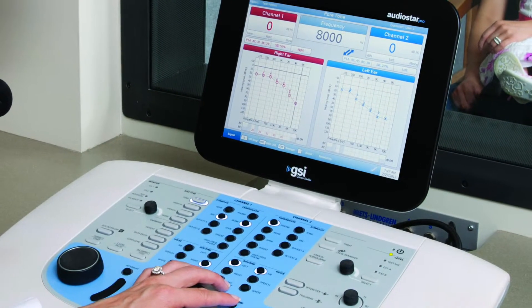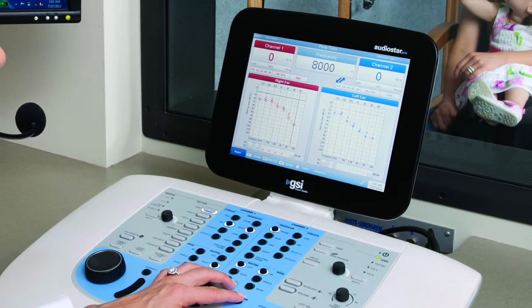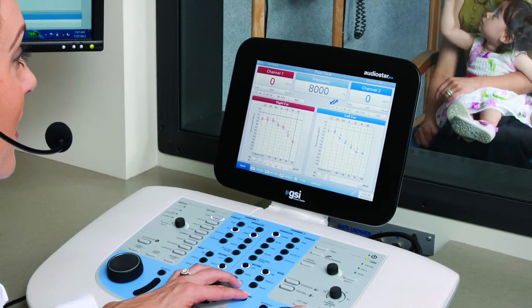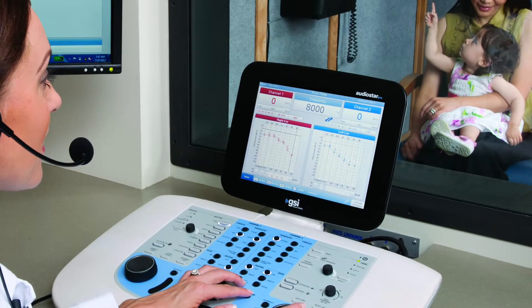The AudioStar Pro comes with over 50 word lists preloaded on the instrument. To reduce the time needed to navigate between word lists, a favorites list can be created.